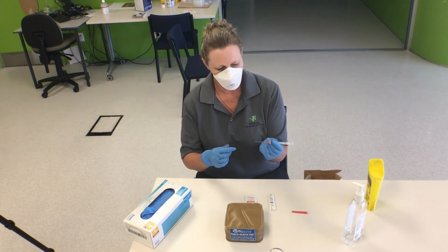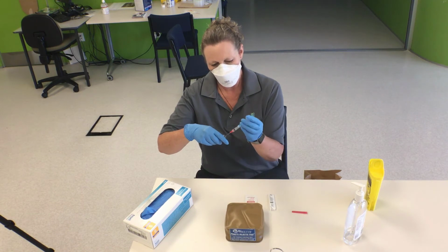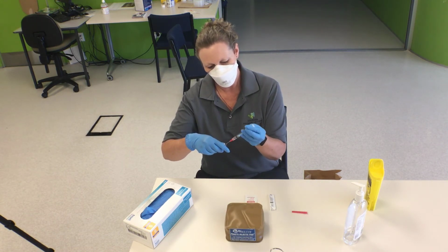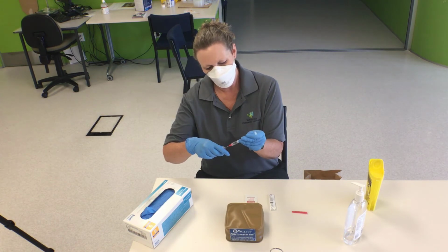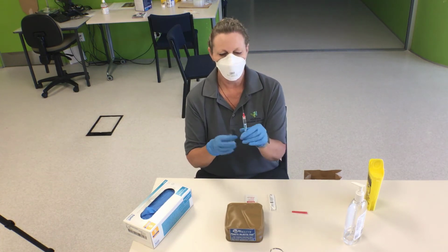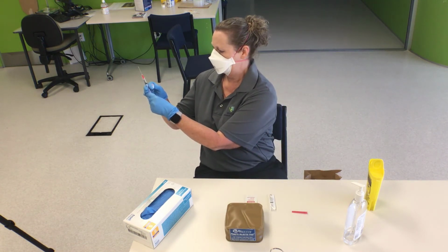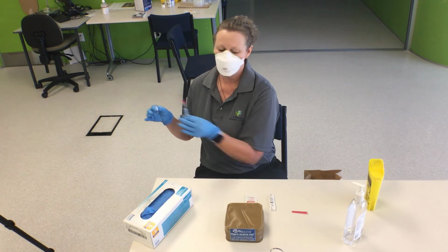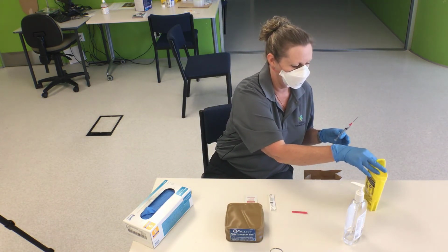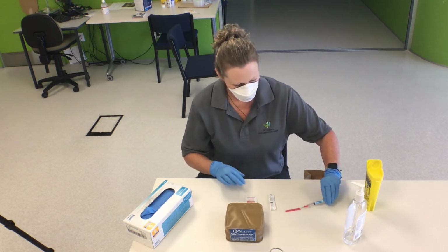I have removed my cover from my drawing up needle, and what I'm doing now is just drawing up just over 1 mil in this ampule, and then just making sure that the plunger is sitting on 1 mil. Once that's there, I can put the medication away and just recap my blunt.